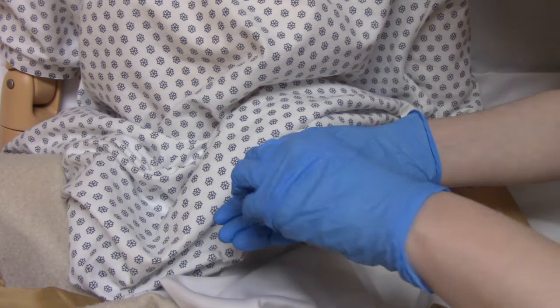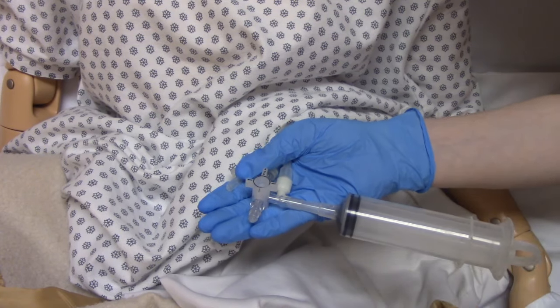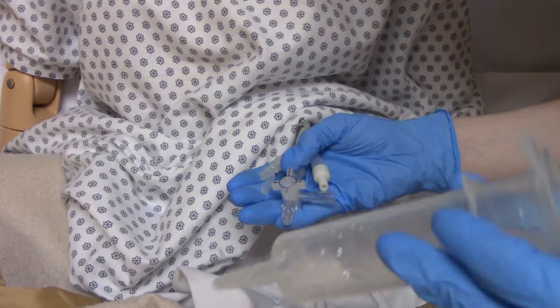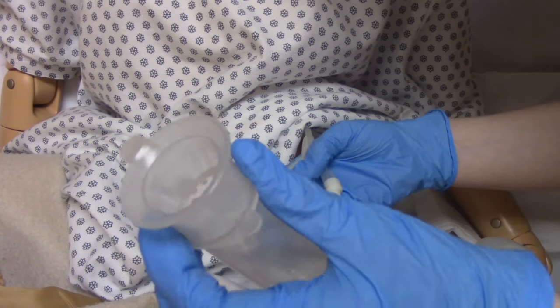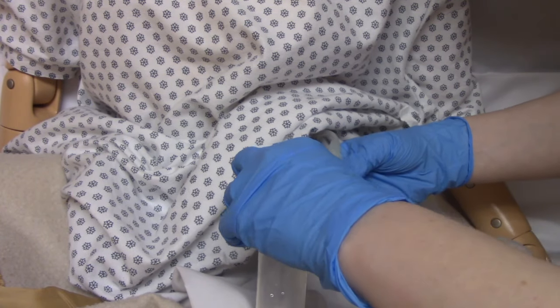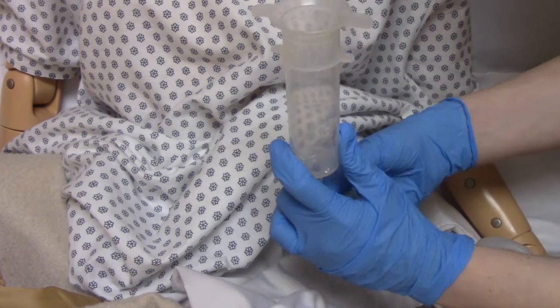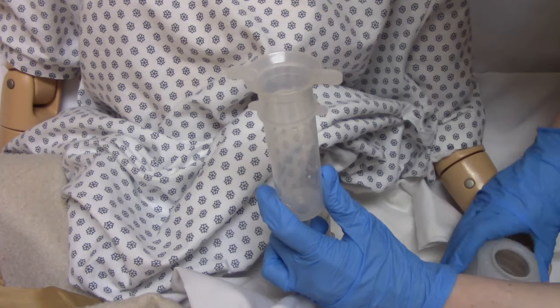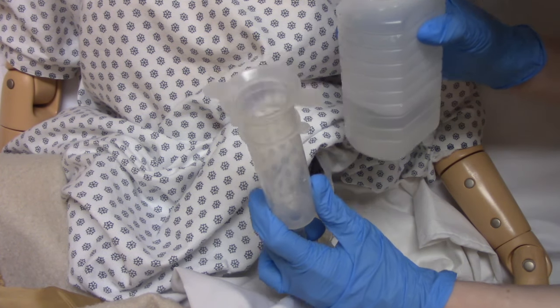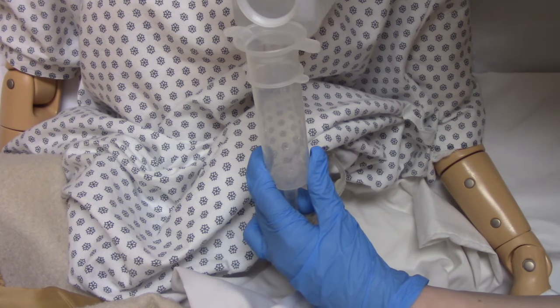Once you've verified placement, turn everything off again so nothing accidentally leaks out. Then take your 60 cc syringe with the plunger removed, turn the valve to open it, place the syringe in the port, and give the patient a 30 ml water flush before administering any medication.